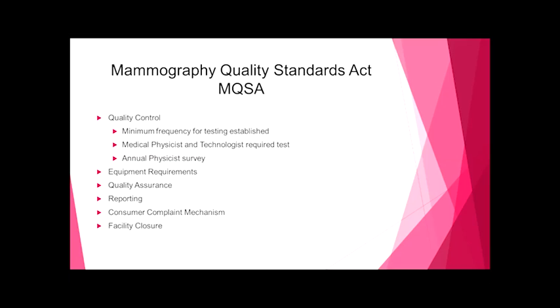Well, we have seen that language used over the years where something that was recommended eventually made its way into the final rules as a requirement. But I think we're seeing the progression of the quality assurance area where they suggested that you do certain things and it's good clinical practice that you would do these, but where they're going to put some components in place that you're going to have to demonstrate what it is that you've been doing.